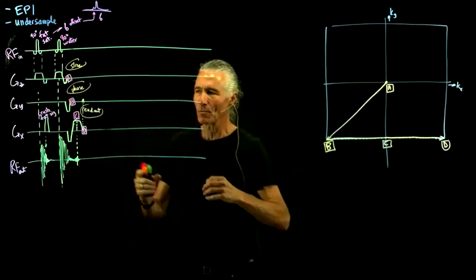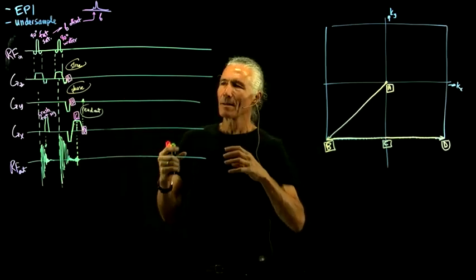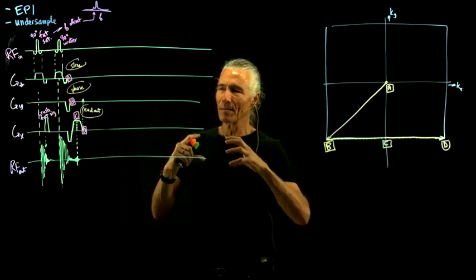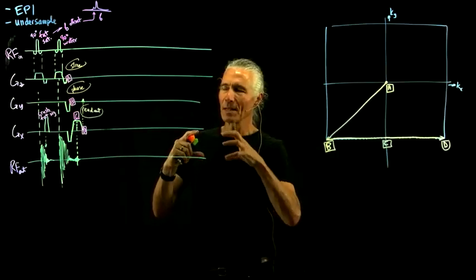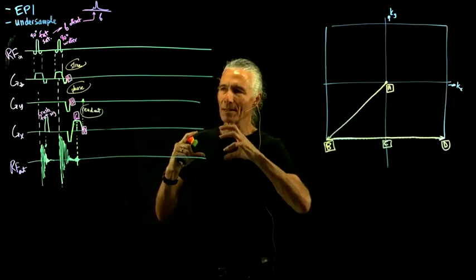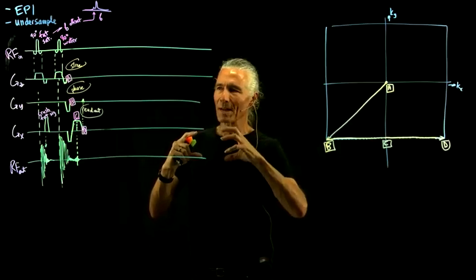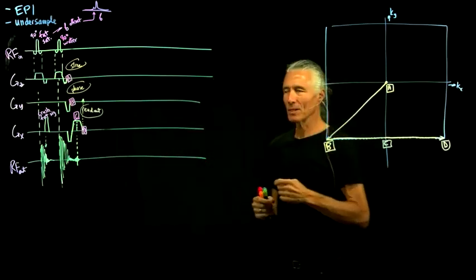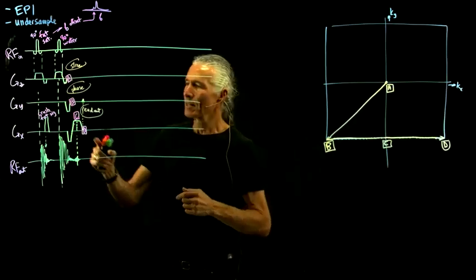That's a really big current going into the gradient coil. The gradient coil generates a magnetic field, and that magnetic field reacts with the B0 field and causes the gradient coil to wobble back and forth. That's what actually makes the noise, that high-pitched beep that you hear.